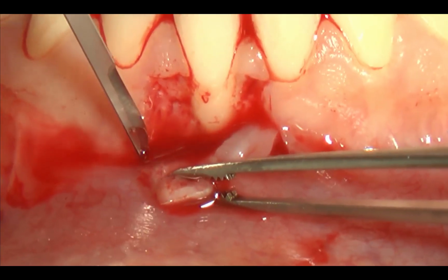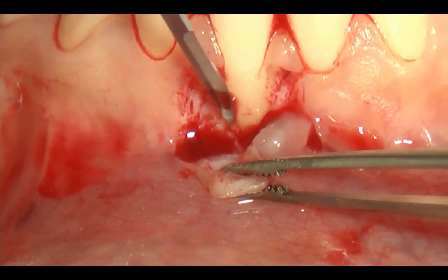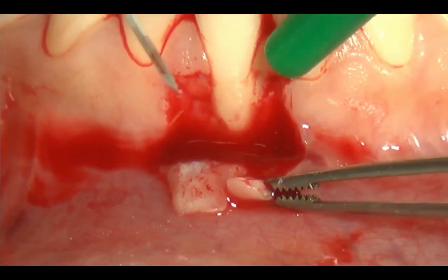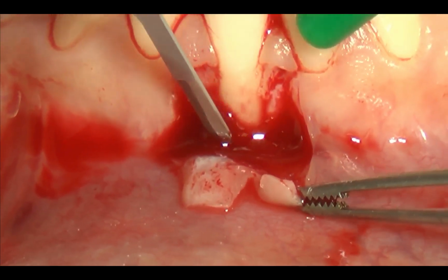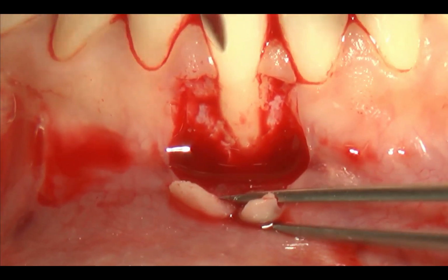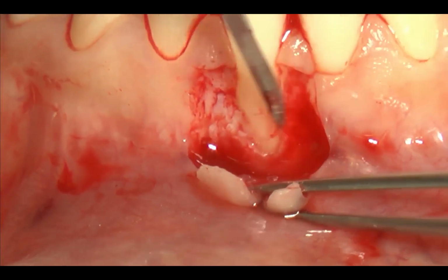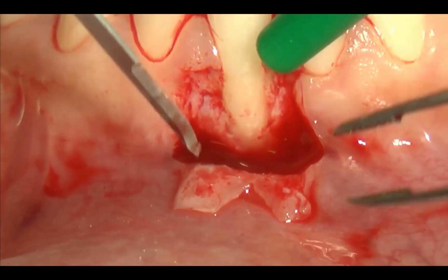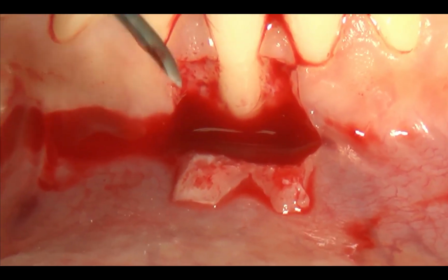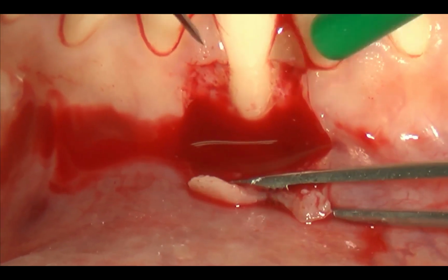Go, pull. Parallel to the bone, deep incision, parallel to the bone, to detach completely the submucosal tissue, right, from the periosteum. And you see now the two papillae are above the lining mucosa of the lip, and they are still completely attached to the lip, right?